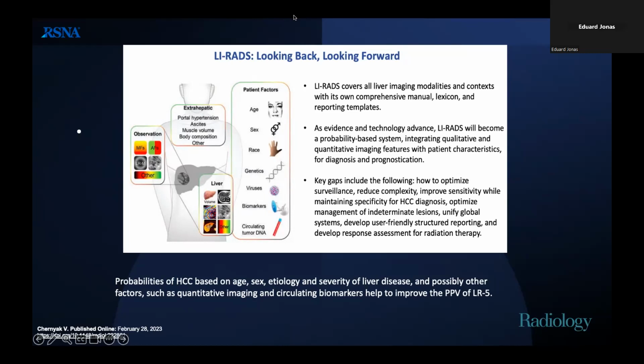Mark, I see there's one question in the chat. Is MRI hyperintensity quantified by number as in CT, Hounsfield units, or is it subjective? Yes. So for MRI, we're looking at the hyperintensity of the lesions and not Hounsfield units.